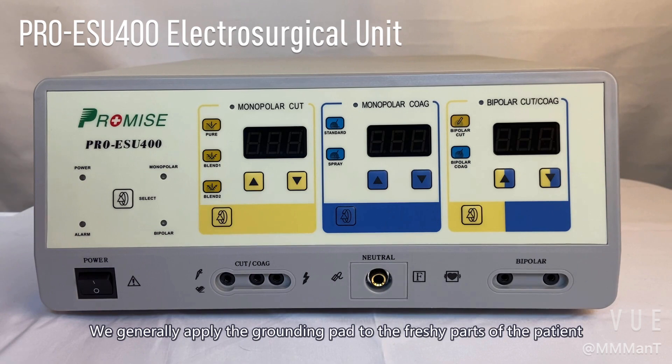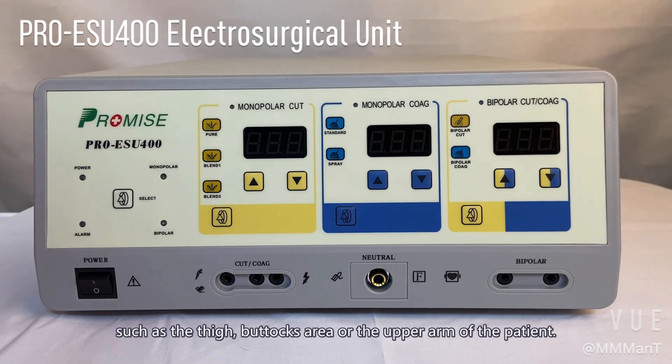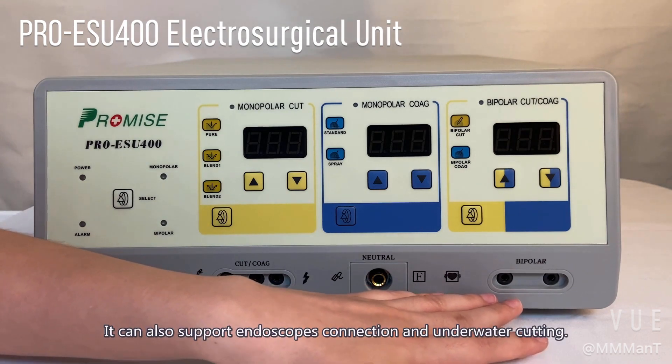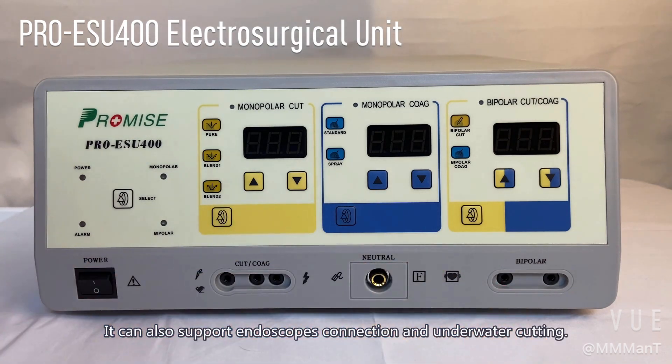We generally apply the grounding pad to the fleshy parts of the patient such as the thigh, buttocks area, or the upper arm of the patient. And this is for the bipolar electrode. It can also support endoscopy connection and underwater cutting.